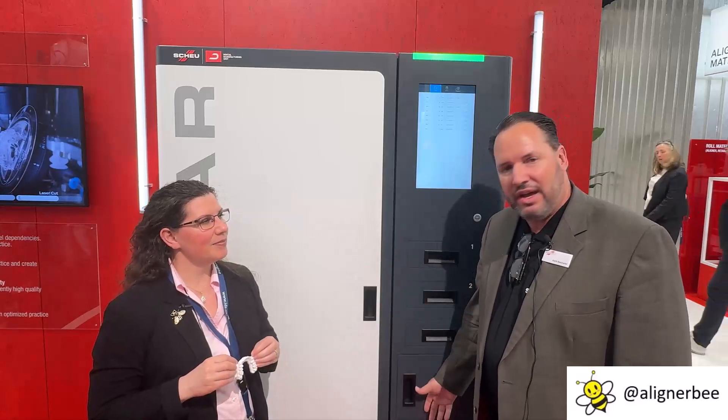And it'll do 100 aligners in 24 hours. So it really frees up staff in your office to just load the filament that is required to 3D print, and then the foils to thermoform and produce the aligner, all within 24 hours.